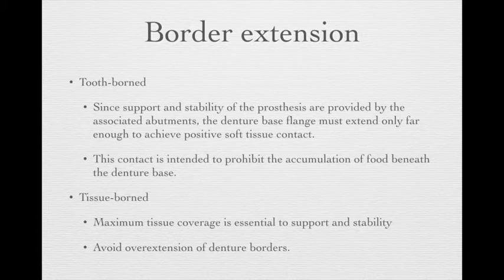However, when we deal with a tissue-borne RPD, we still want maximum tissue coverage, just like in complete dentures, because we still need to use those soft tissues to provide good support and stability. And we still need to avoid overextension of the denture borders.